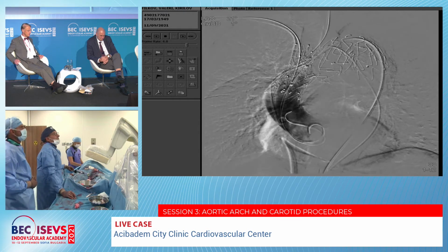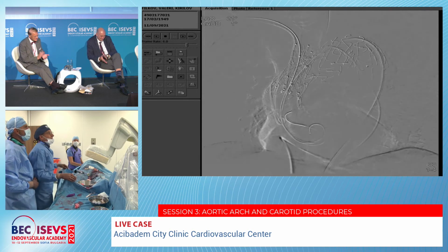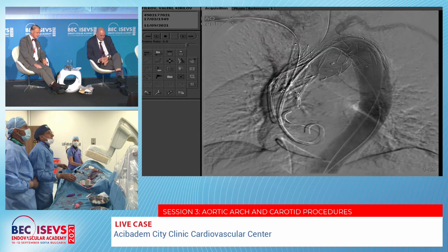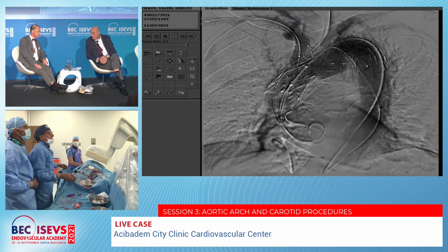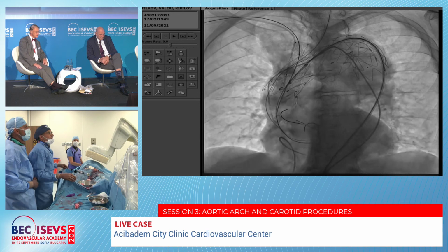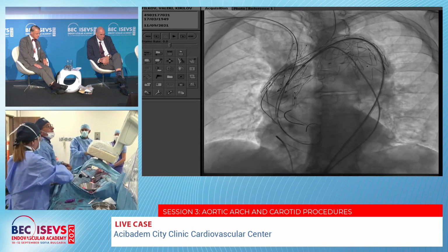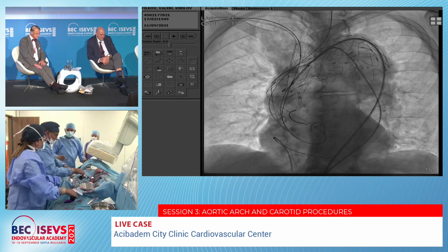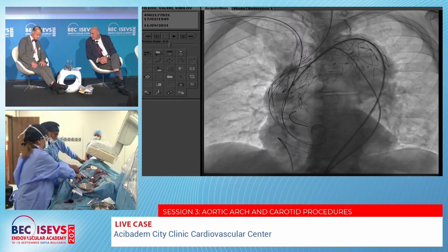So I think we can now clap the hands, yes. Very impressive result. Did we lose the connection? We don't hear anything. I don't know if they can hear us or not. But it's very impressive how they can reconstruct the arch.